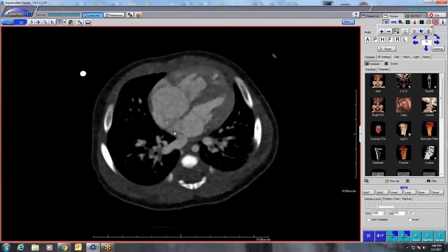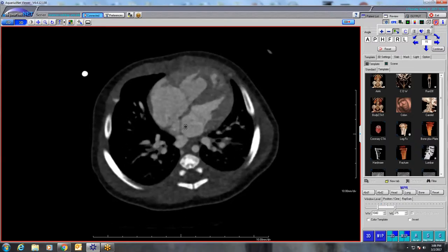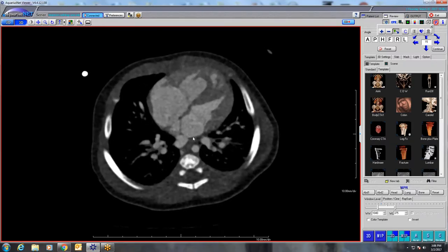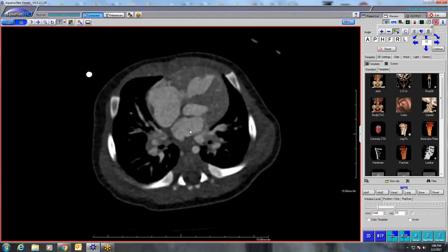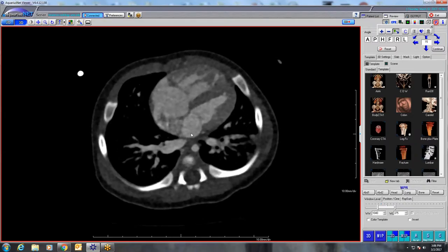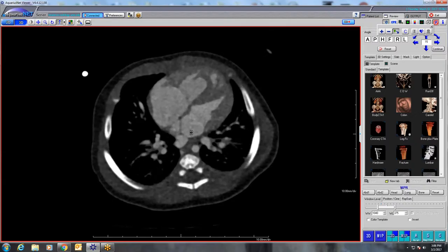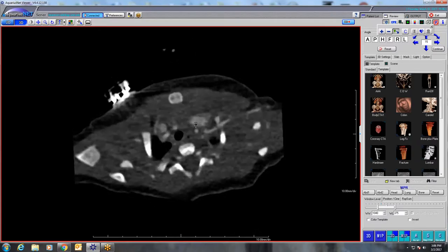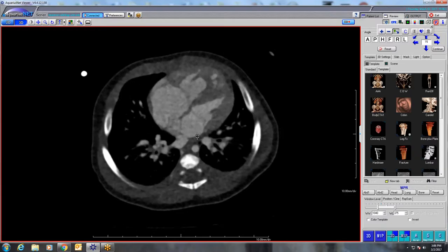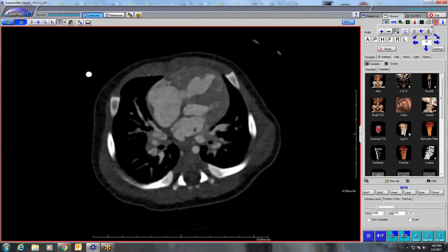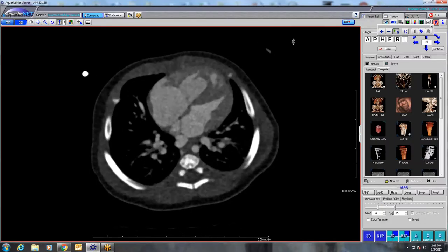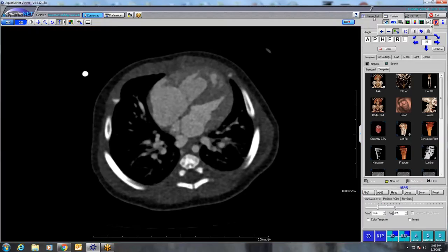The question is, we're not really sure which way this vein is directed — whether flow is directed from the left atrium into the right atrium through the inferior sinus venosus because of this band, or if it's unattached enough to still get into the left atrium. It's three out of four veins definitely going the wrong way, and the question is whether this one is also being shunted the wrong way — possibly a very strange TAPVR. Anyway, I thought this was an absolutely fascinating case. You can see the right heart is way too big and hypertrophied, and there was no VSD or anything. So a weird TAPVR verging on TAPVR because of a cor triatriatum or at least an atrial band.